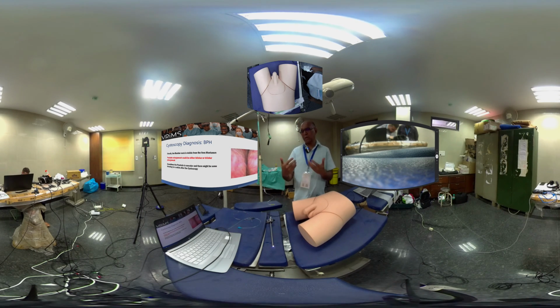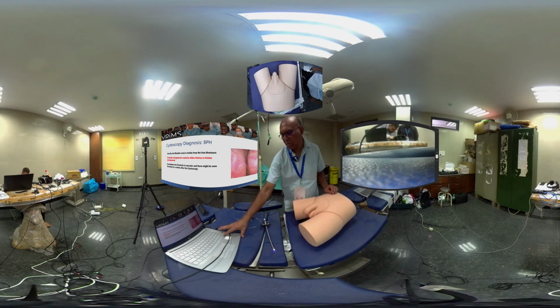So this is called bilobar obstructive prostate. So you can see the prostate blocking. If you see the verumontanum, and with the scope, if you look from the veru, say imagine this is the veru, you should be able to get into or see the scope comfortably. But if the prostate is enlarged like this, you will not be able to do that.